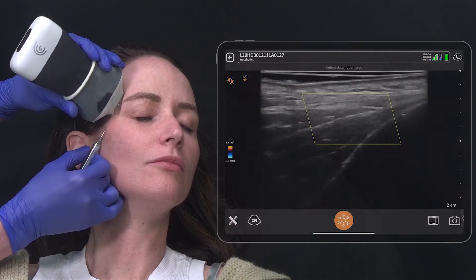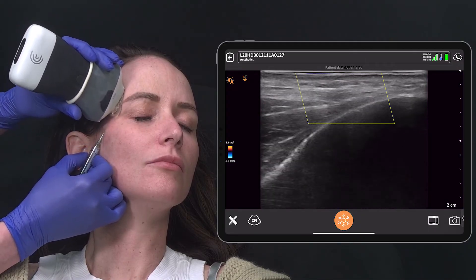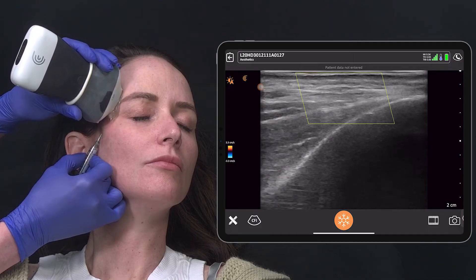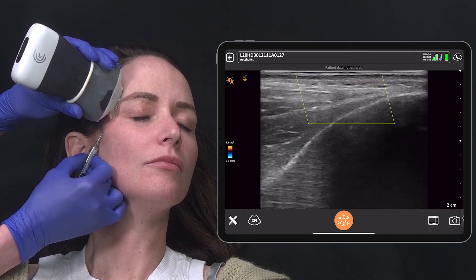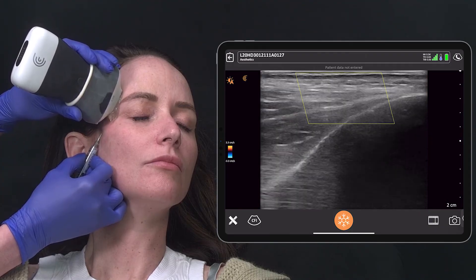Starting the treatment itself, I've inserted my cannula into the tissue and I can apply my Clarius to check it is in the right layer — the interfascial plane. I find my cannula with a few gentle movements of the Clarius. The first thing I see is the reverberation artifact, which tells me I am very close to the cannula. And there it is! I can see it is in the interfascial plane, beneath the superficial temporal fascia.